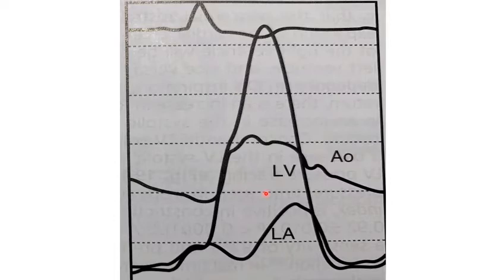Yes, sir. Here the LA pressure is also high. Yeah, LA pressure is high. Which wave is high? V wave is high. So the patient is having associated? MR. Mitral regurgitation. So this is a patient of dynamic obstruction, hypertrophic cardiomyopathy with mitral regurgitation.